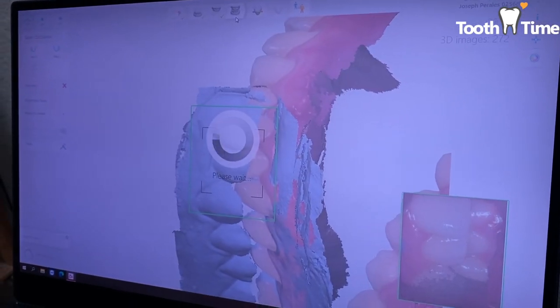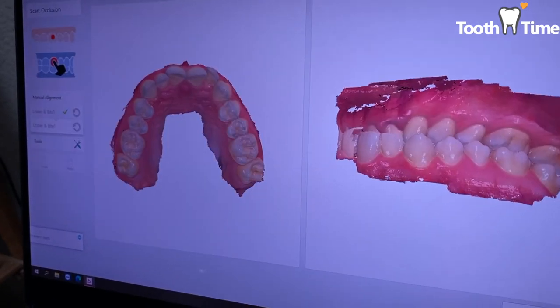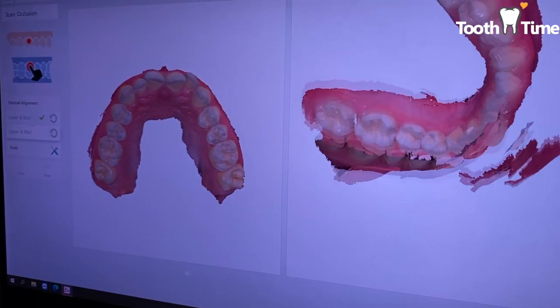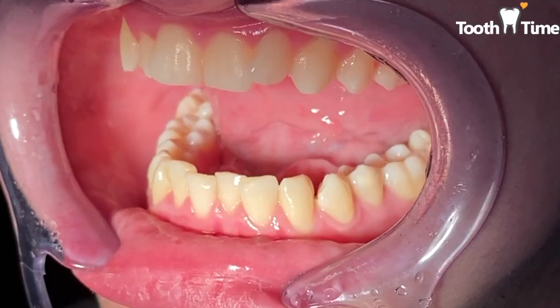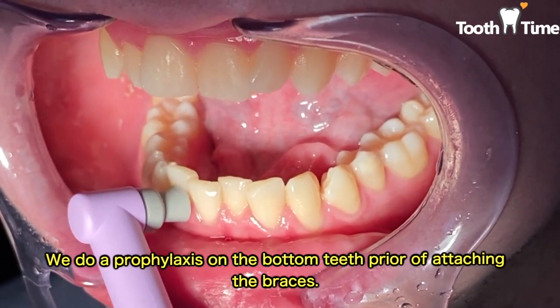If you're curious, when I say we're gonna scan the teeth, what I mean by that is digital impressions. So when you go into the dentist's office and sometimes they take those gooey moldings of your teeth, in that case we've kind of already moved away from that, and so this is a lot more comfortable for the patient where we scan the top teeth and the bottom teeth.